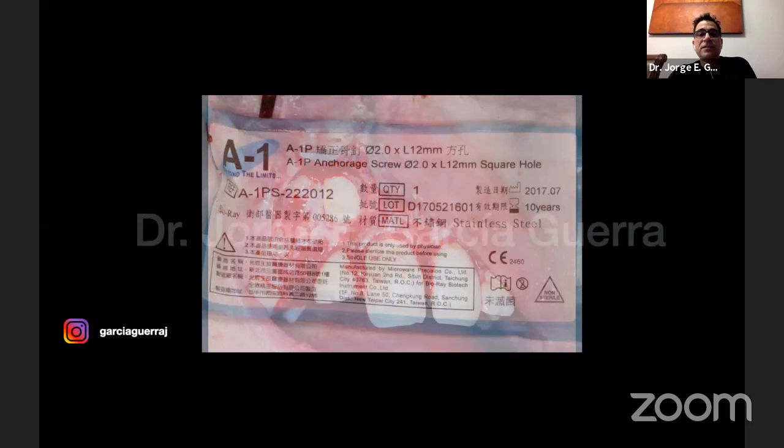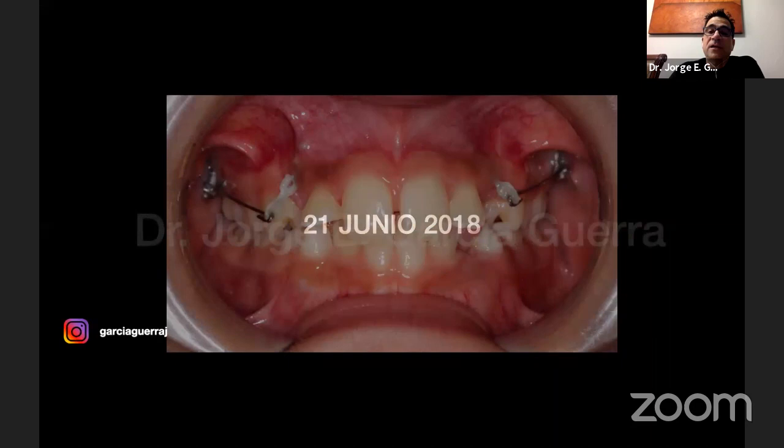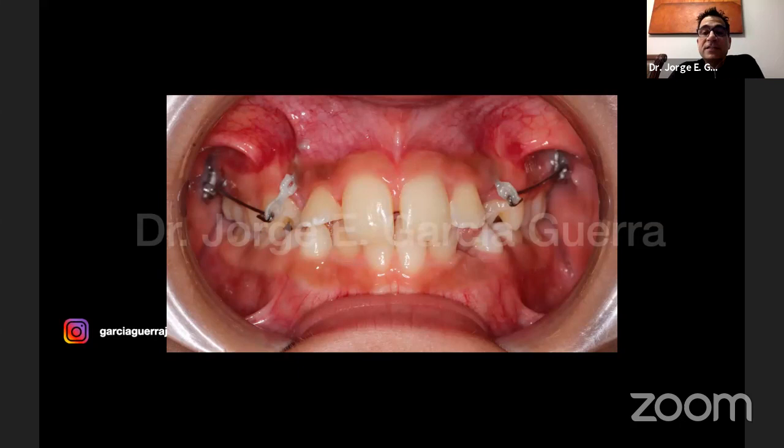They're 2x12. And this is a month later. You can see how we have the two mini implants and this lever arm. This lever arm is made with a 19x25 stainless steel wire. The objective here is that we're using some power chains. In this case, we're using a memory chain from American Orthodontics.